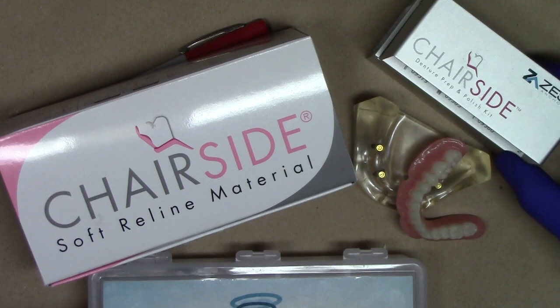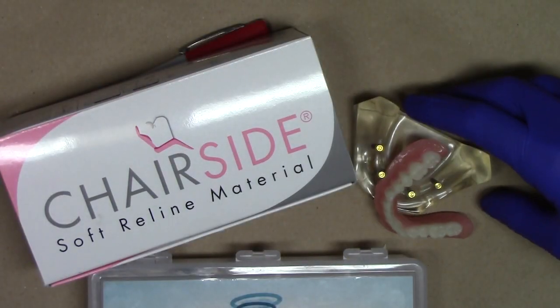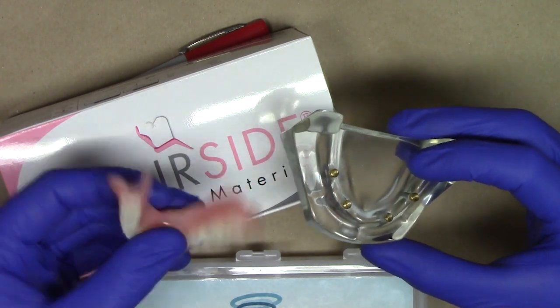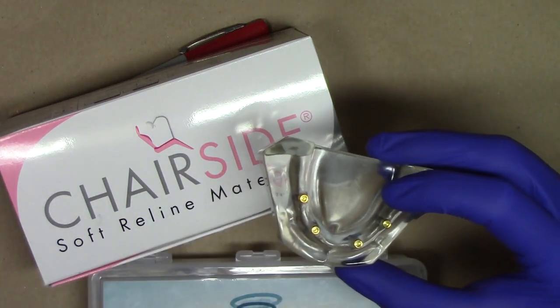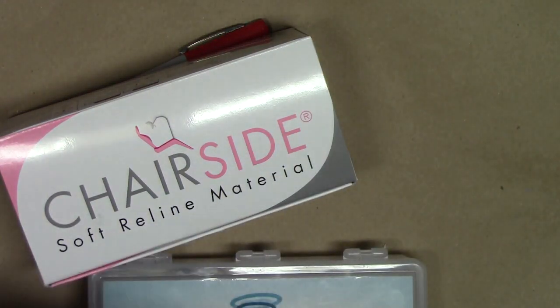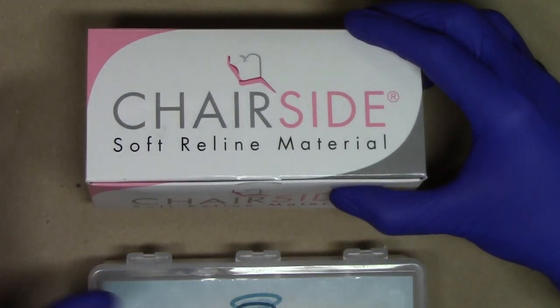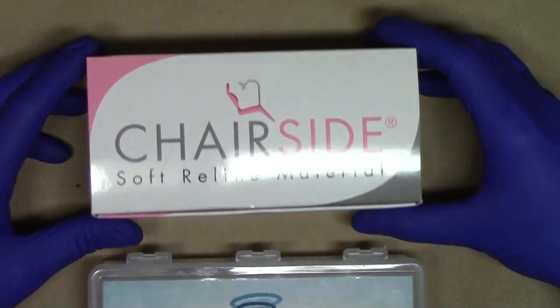So I'm going to be demonstrating today, using all of my standard instruments, a reline of my overdenture immediately after implant placement. I'm going to set that aside for a moment just to describe everything that you see in front of you in the Zest CHAIRSIDE Soft Reline Material pack.